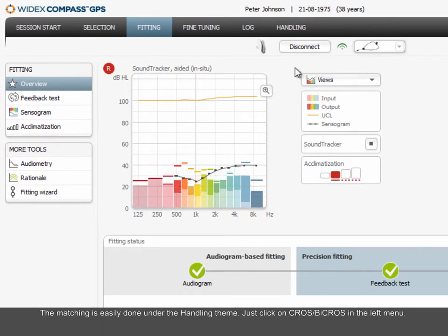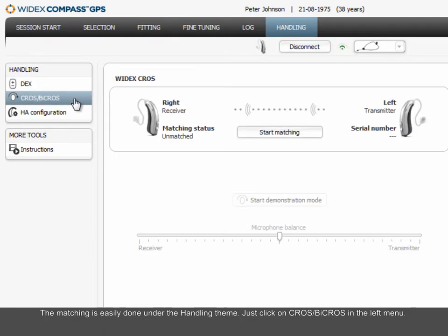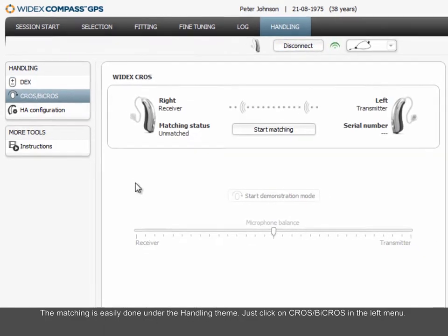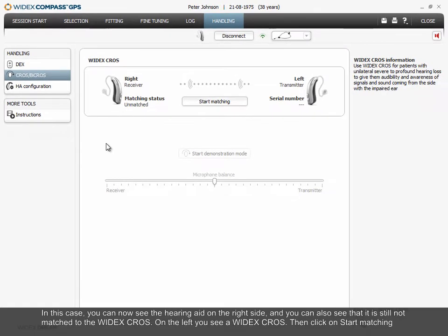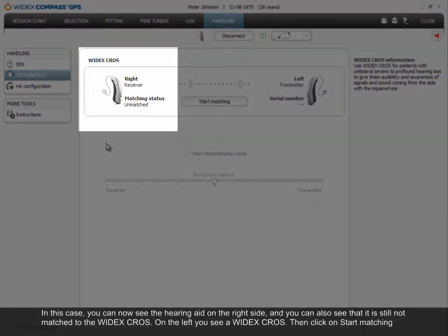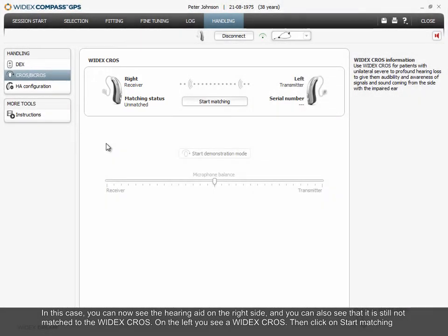The matching is easily done under the Handling theme. Just click on CROS by CROS in the left menu. In this case, you can now see the hearing aid on the right side, and you can also see that it is still not matched to the Widex CROS. On the left, you see a Widex CROS. Then click on Start Matching.